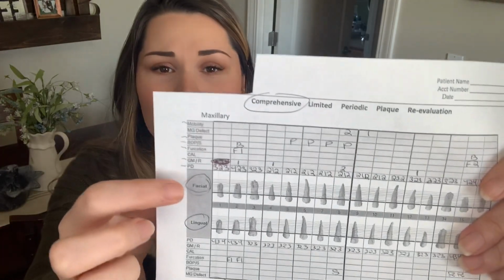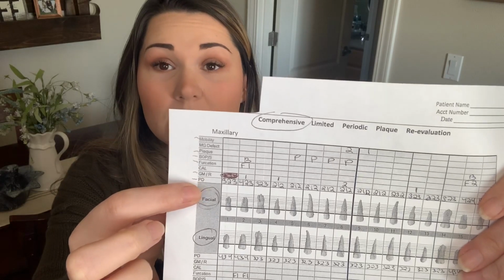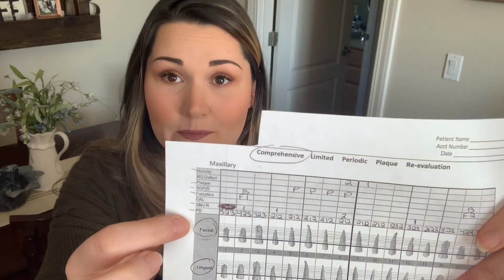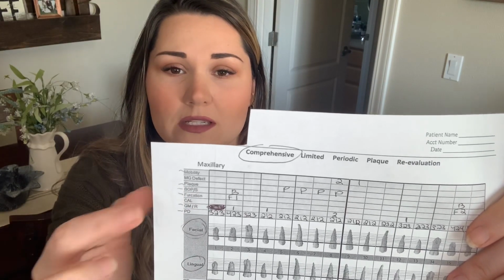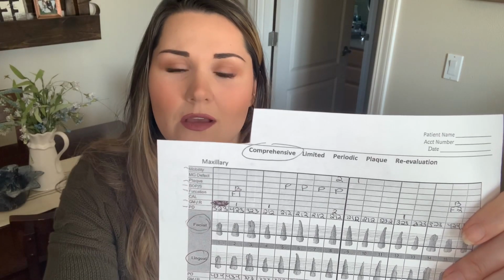They usually just give you the PD, which is the periodontal depth, the pocket depth of the tooth, gum recession, the furcation measurement, blood, and then suppuration, which is like pus or something like that. And then you have plaque, and then you have mobility. Those are the most common readings that I enter for the hygienist.